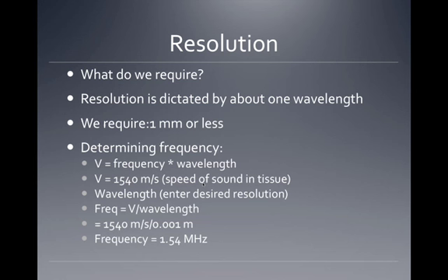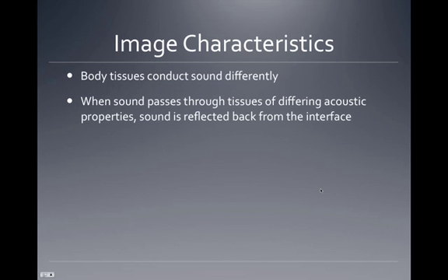All right, so for our physical therapy purposes, do we need a millimeter? Probably not. Okay, but pretty fine gauge there that we're judging a millimeter or less in resolution. So pretty good machine. All right, so the stuff about determining frequency, not too worried about that. So just kind of skip through that part.